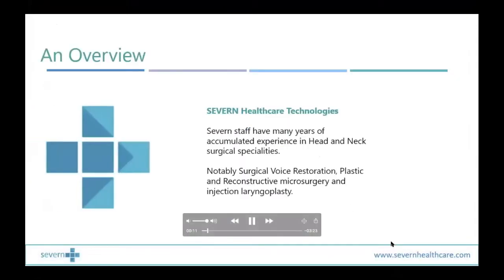Severn Healthcare, for those of you who are unfamiliar with us, are a medical device distributor based in the UK, focusing on head and neck surgical specialties, and within the field of ENT, most notably surgical voice restoration, tracheostoma care, plastic and reconstructive microsurgery, and more recently, injection laryngoplasty.